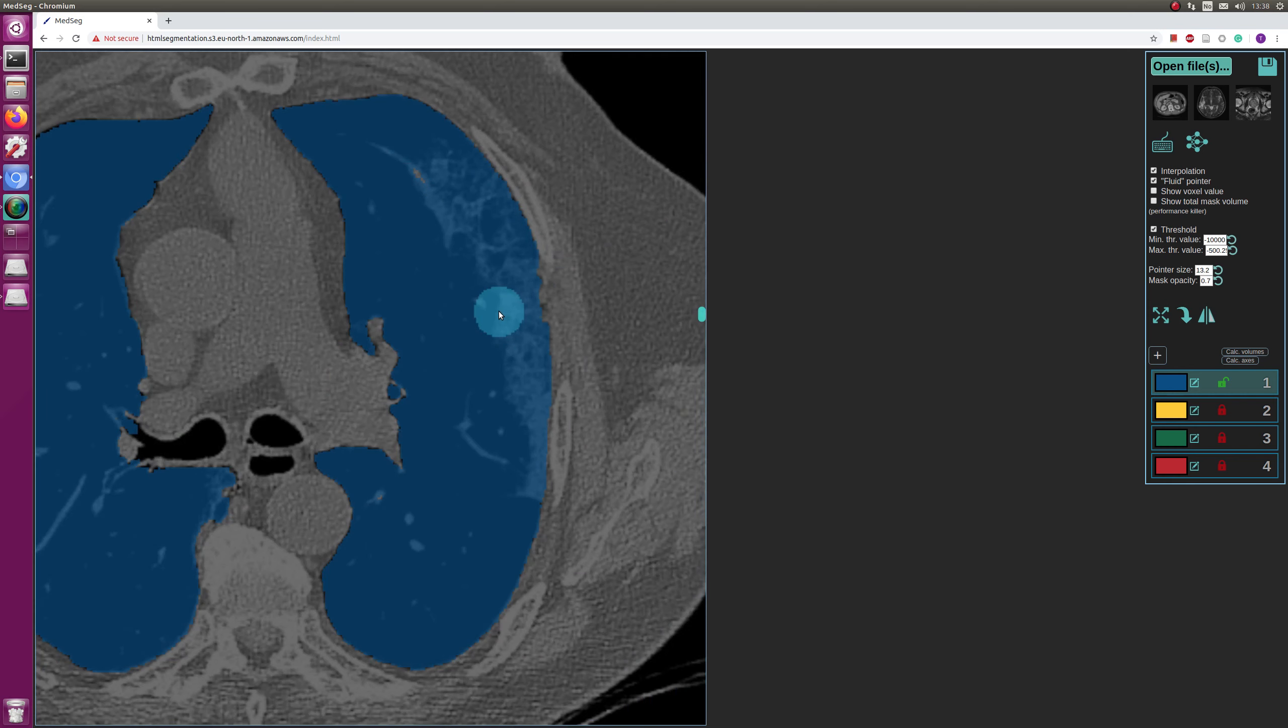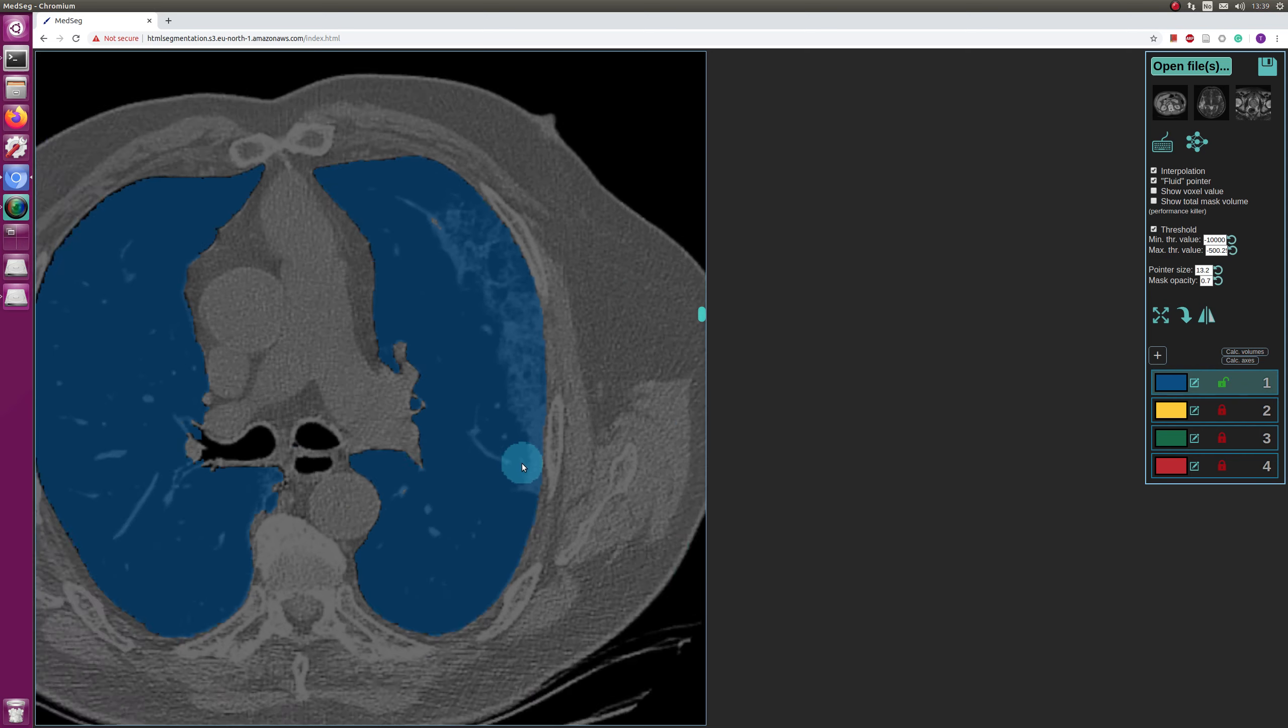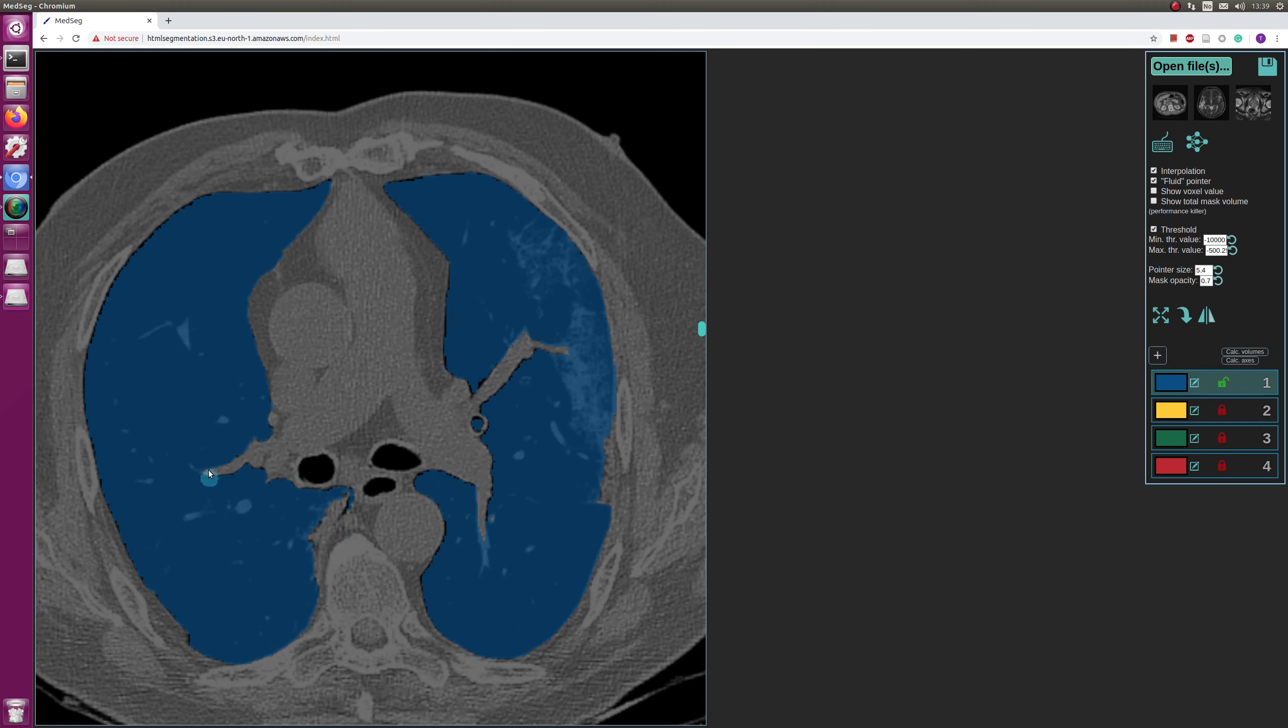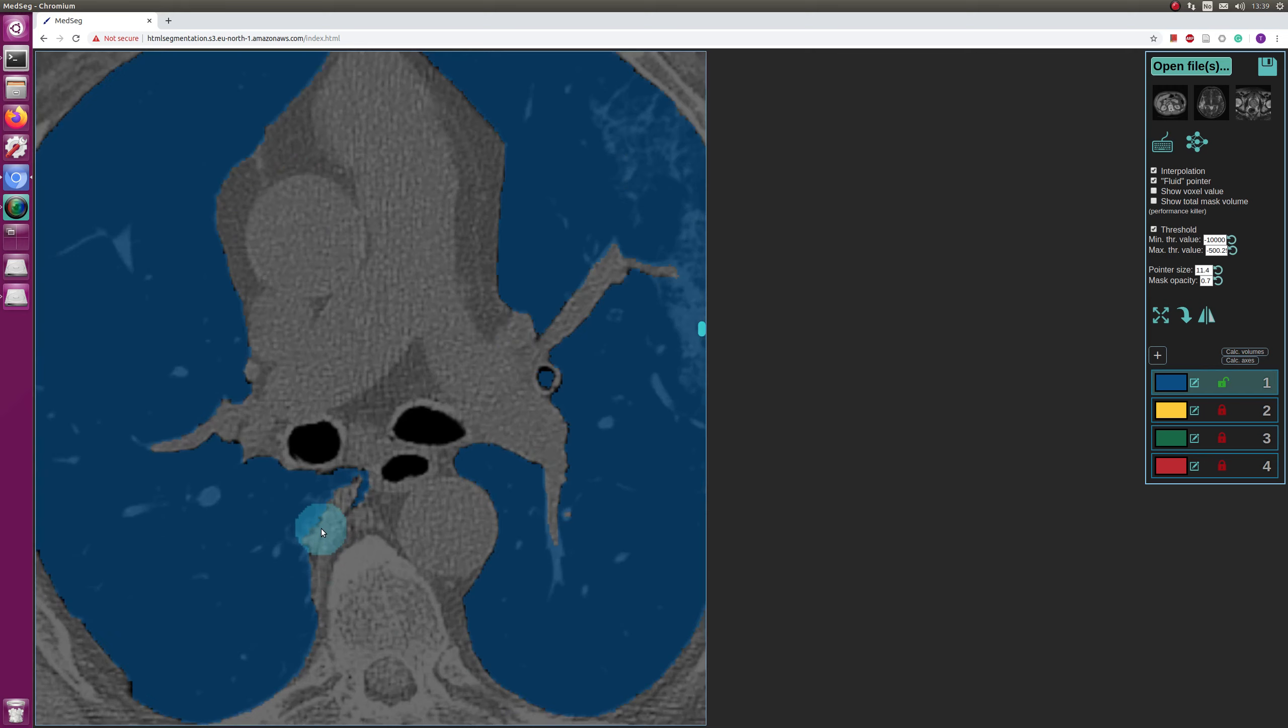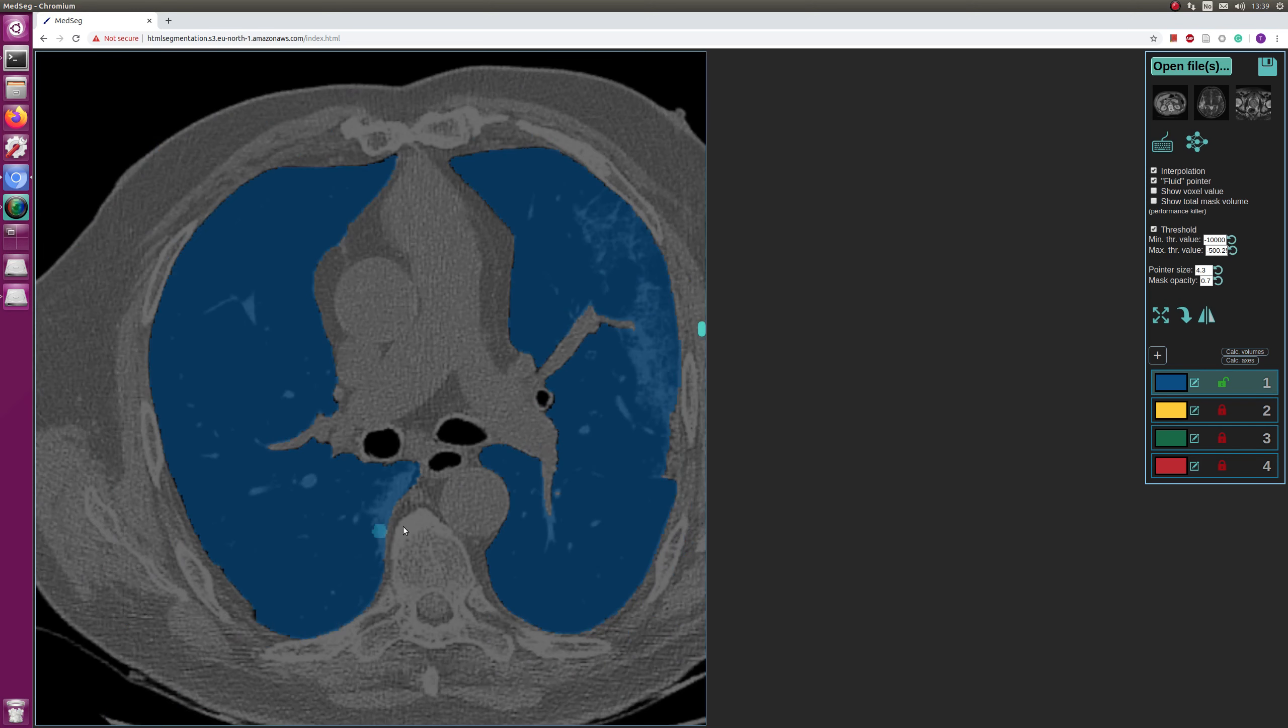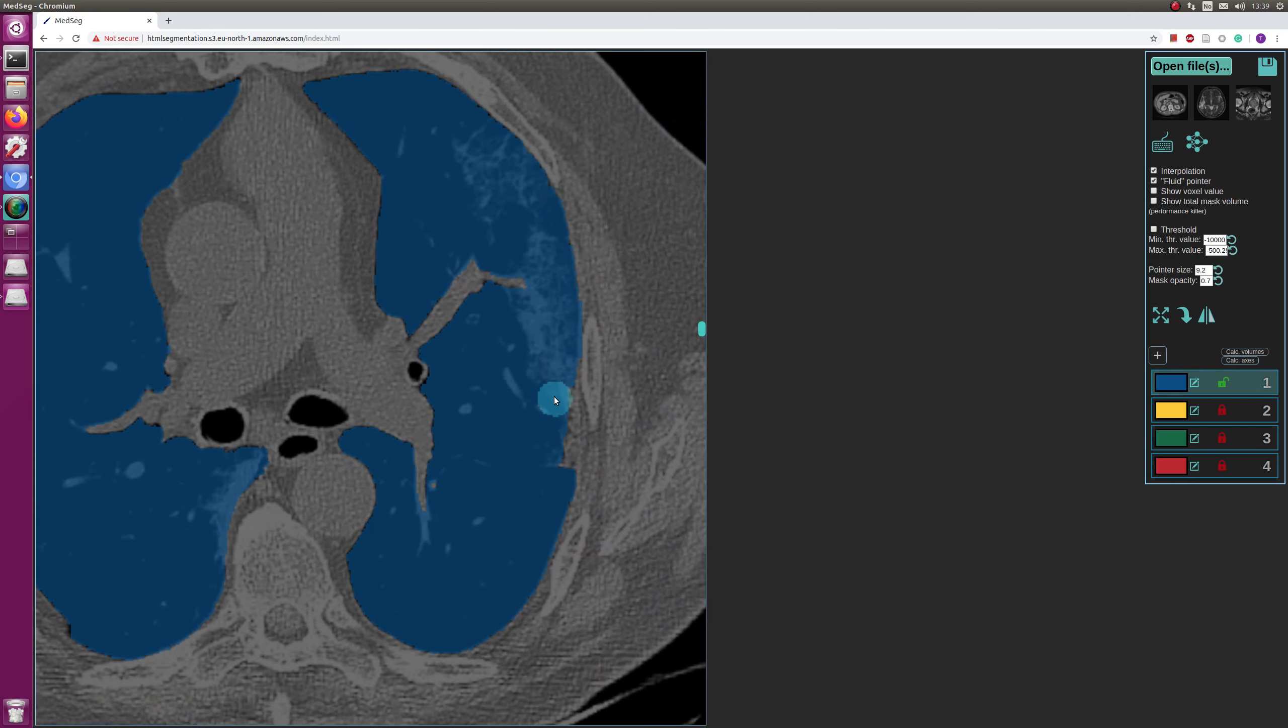So with the press of the letter T I deactivate thresholding, so now it can paint all over, and if I activate it then it doesn't paint here. You see it's activated here, and you see it took a bit of the bronchi, takes a bit too little there. Now you see it missed all of this area right here, so this is actually quite bad performance of the model. So it's okay I guess, but it has some real improvement potential.